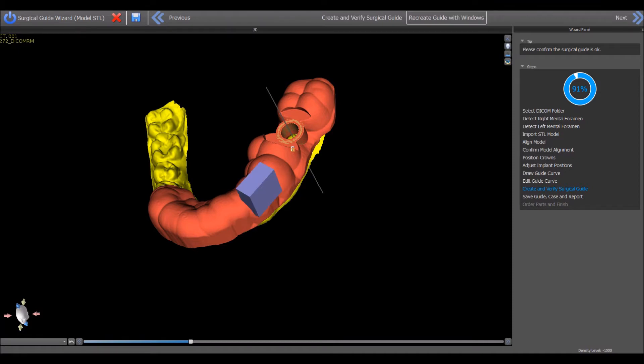The rectangular block will appear on the screen. The block represents the location and size of the window that will be created in the surgical guide.